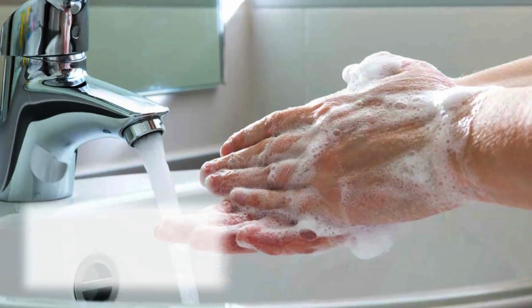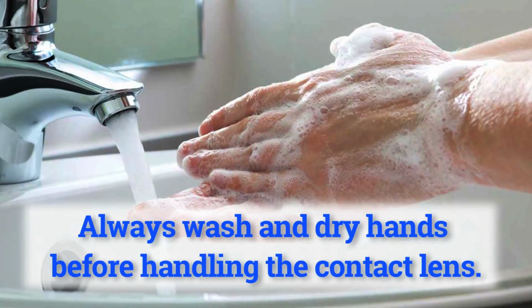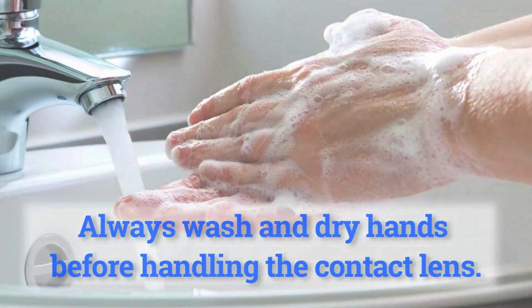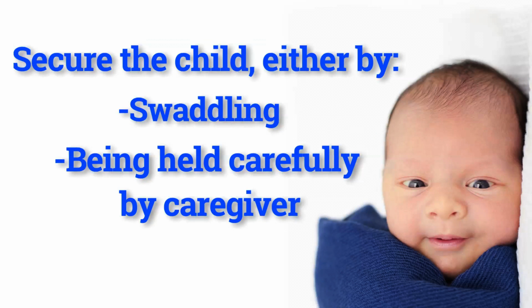It is extremely important that you always remember to wash your hands thoroughly and dry thoroughly prior to handling the contact lens. Let's start with having the child nicely tucked in, either from being swaddled by blankets or having a caregiver carefully hold onto the child so that their arms and legs are secure.